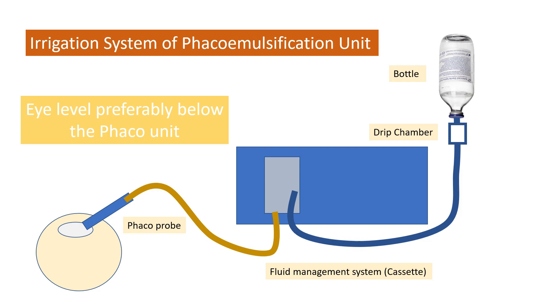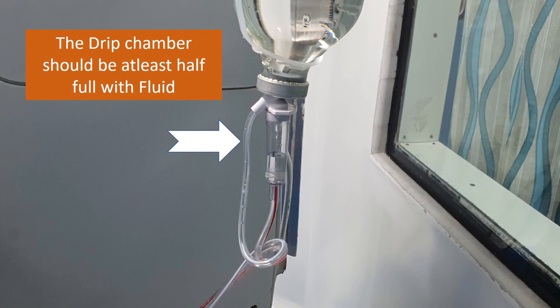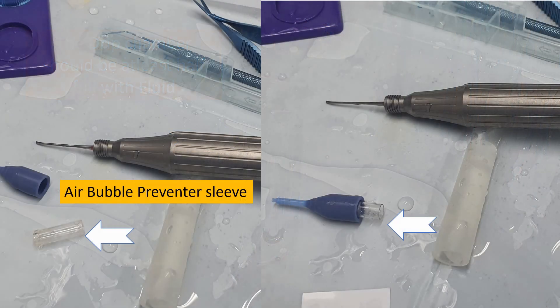The drip chamber is an important part of the IV set and it should be at least half full before you start priming, to avoid any air entering the line. If by mistake you have started priming with air in the drip chamber, you should redo it after filling the chamber completely, to avoid air present in the irrigation line.